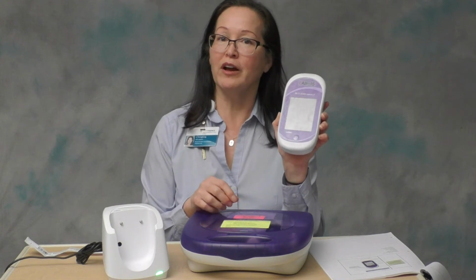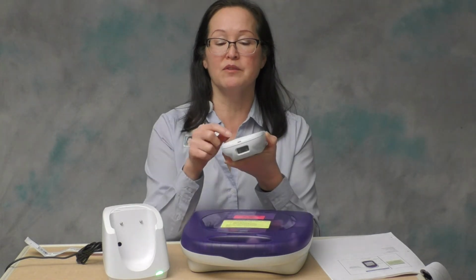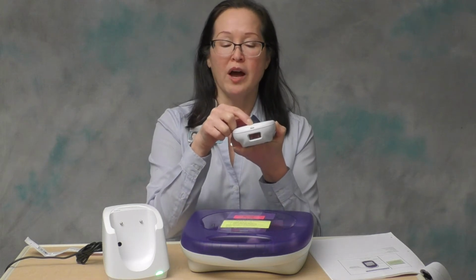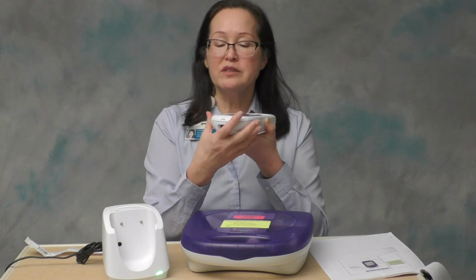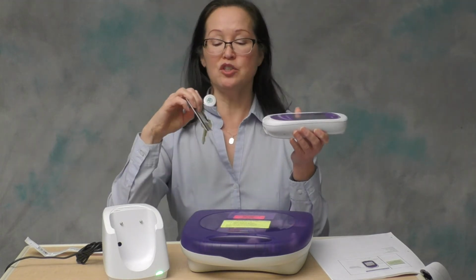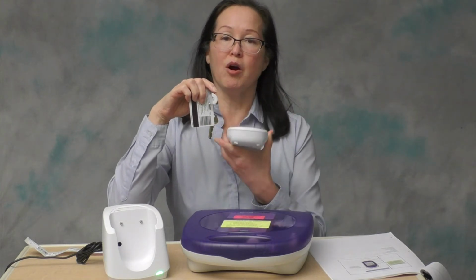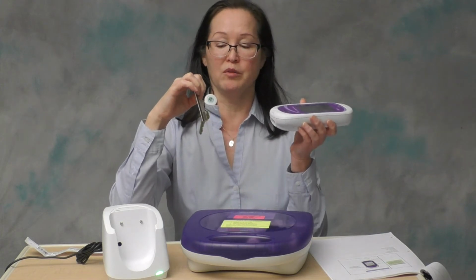So just an FYI, in the last month we've taken about 4 of these meters out of service because they've either been contaminated with blood or QC solution. So do your best to ensure that that test strip port remains dry at all times. Just below the test strip port is a scanning window. This scanner works best if the barcode is held about 6 inches away from the scanning window. And keep in mind, you need to make sure that the bars on the barcode that you're scanning are perpendicular to the scanning window. That's the only way to scan.